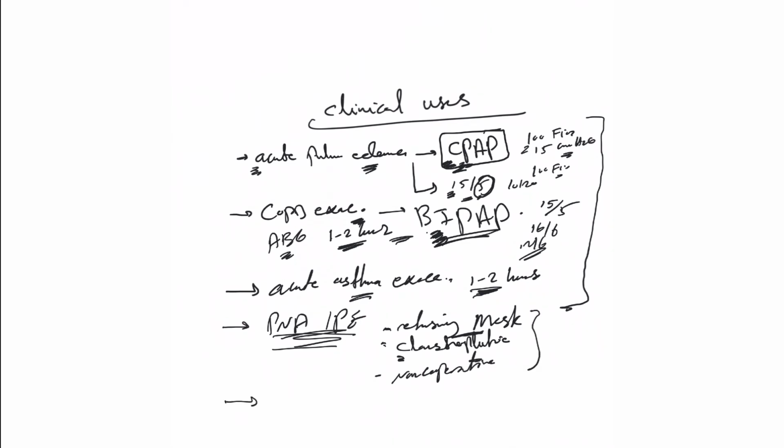Then this is the role of high flow nasal cannula, or the other name, Vapotherm, the brand name. Again, if I'm thinking about non-invasive ventilation, think about BiPAP and CPAP first, unless the patient is refusing those modes, or as I said, refusing the mask, claustrophobic and refusing to wear it and keeps taking it off, non-cooperative. That's when we can use it.